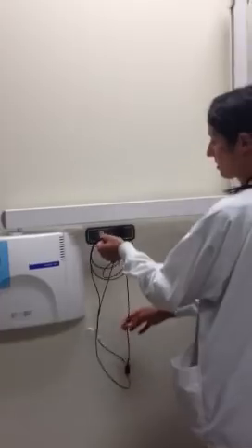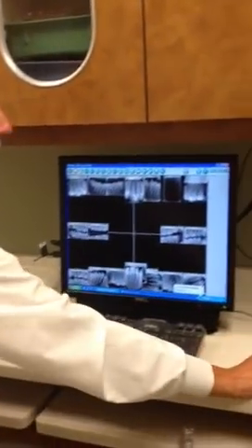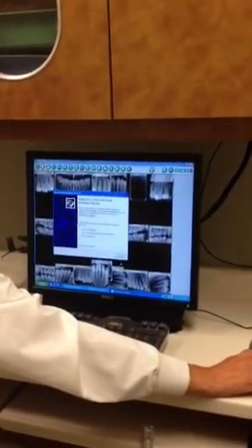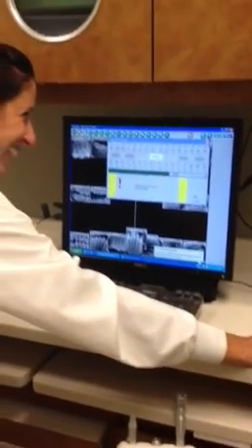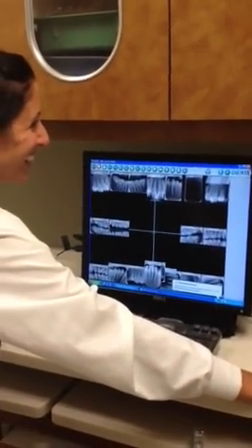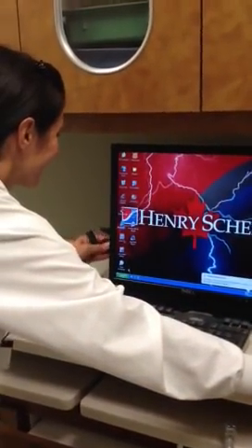We should insert the sensor into the computer first. Now when I hit the radiation protection symbol again, we should be able to see green, so we'll try this again.